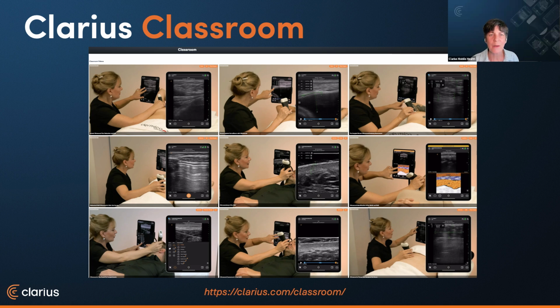Amazing. So I also want to let everyone know that we didn't see any live scanning by Dr. Ravera, but we have a bunch of recordings of her scanning those areas. So you can see some live demos, and that's all on our Clarius Classroom. So if you want to just go to our website and visit the Clarius Classroom, you can see some really good demonstrations by Dr. Ravera there. So great. All right. So as you can see, T-mode just might be the tool you need, that little nudge to get you started recognizing different facial anatomy with ultrasound.